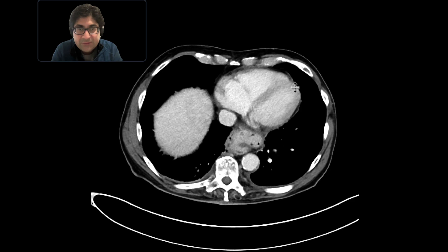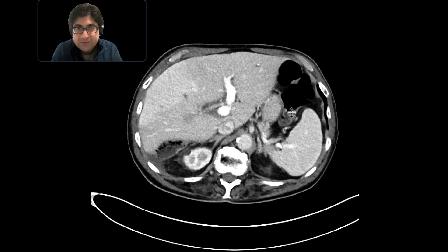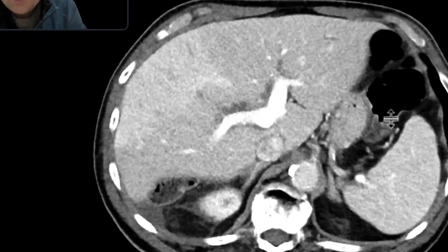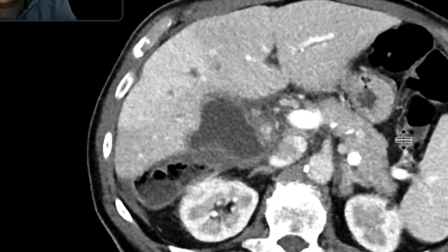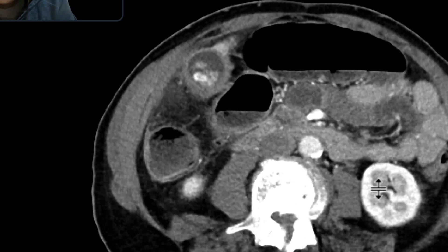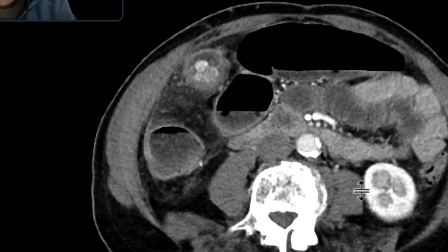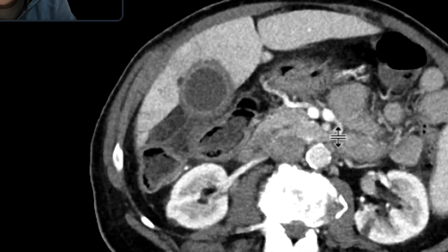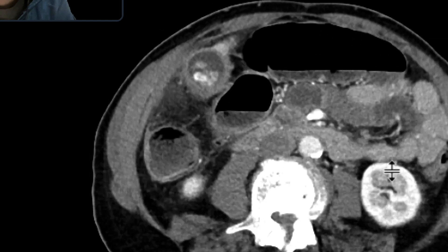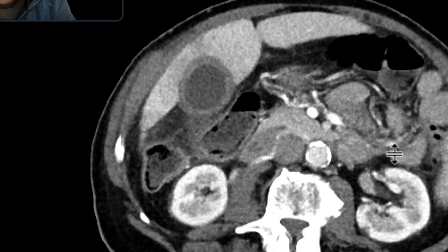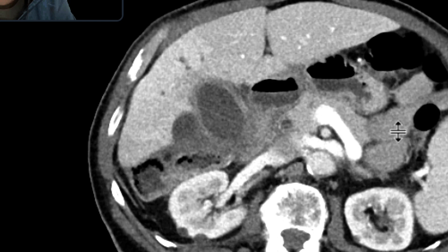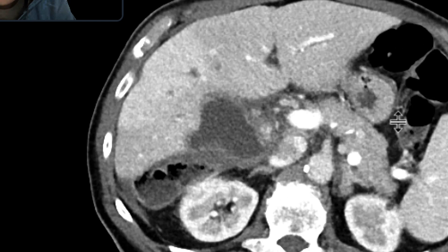We did the CT with intravenous contrast. We can immediately see that there are some abnormalities in the right upper quadrant. Focusing on the gallbladder — it is a little bit distended, there are some stones, but the wall is very, very thick. There is a lot of inflammatory change and fat stranding surrounding it. And if we follow the wall of the gallbladder, we notice that right around here there is a defect.